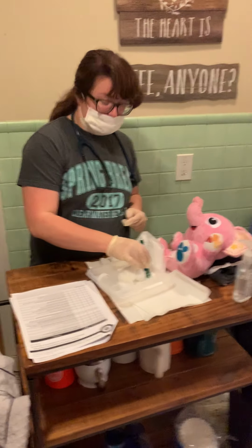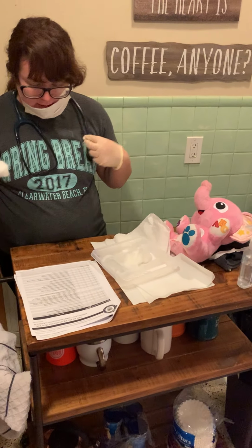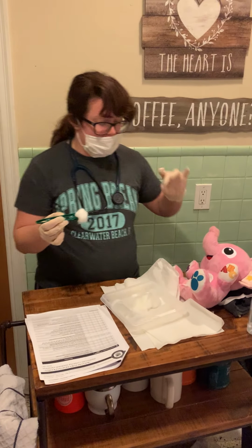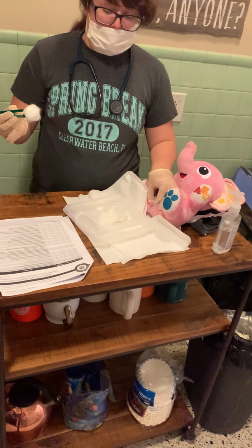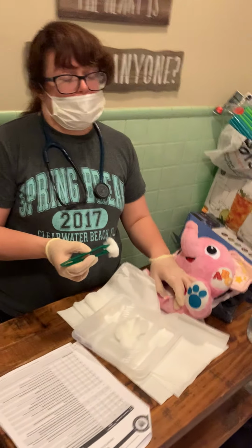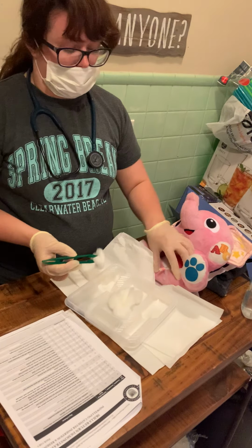And we're going to use one swab at a time, and we are going to only do one swipe per cotton ball. I'm going to use my non-dominant hand to spread the labia minora, and I'm going to continue to keep my hand in this position. Well, obviously at first you would let your patient know that you're going to be touching them in the first place and make sure you have their permission to be touching the sensitive area.